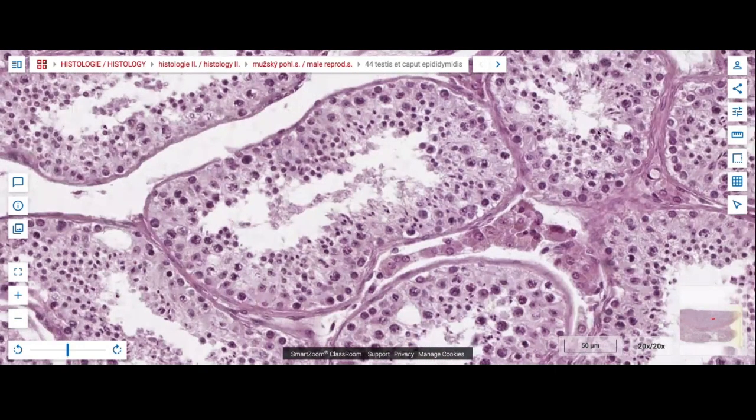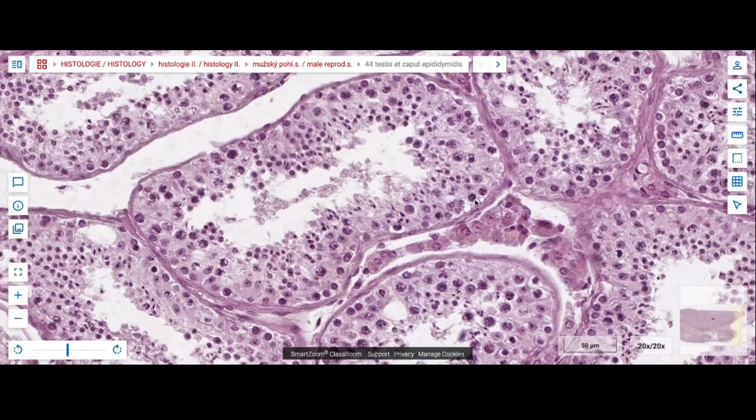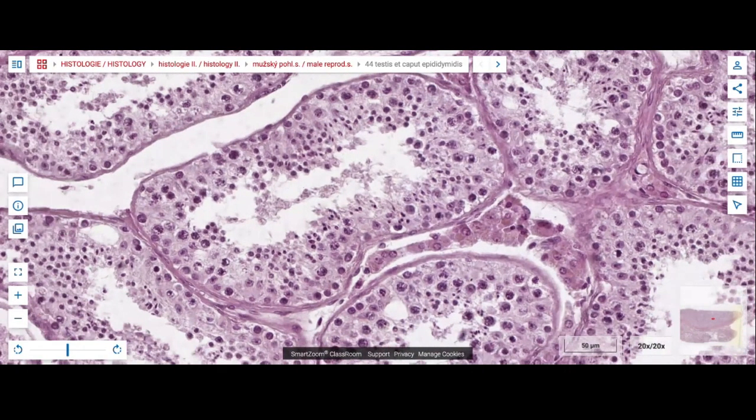Spermatogenic cells have approximately 5 stages. The first one is the spermatogonia, the very first stage of the sexual gametes. The spermatogonia, this one with a really dark nucleus, would be the spermatogonia. They're located near the lining, not near the lumen. They're located on this side. These then undergo division to form primary spermatocytes. Primary spermatocytes are situated above the spermatogonia, and they are the largest cells.